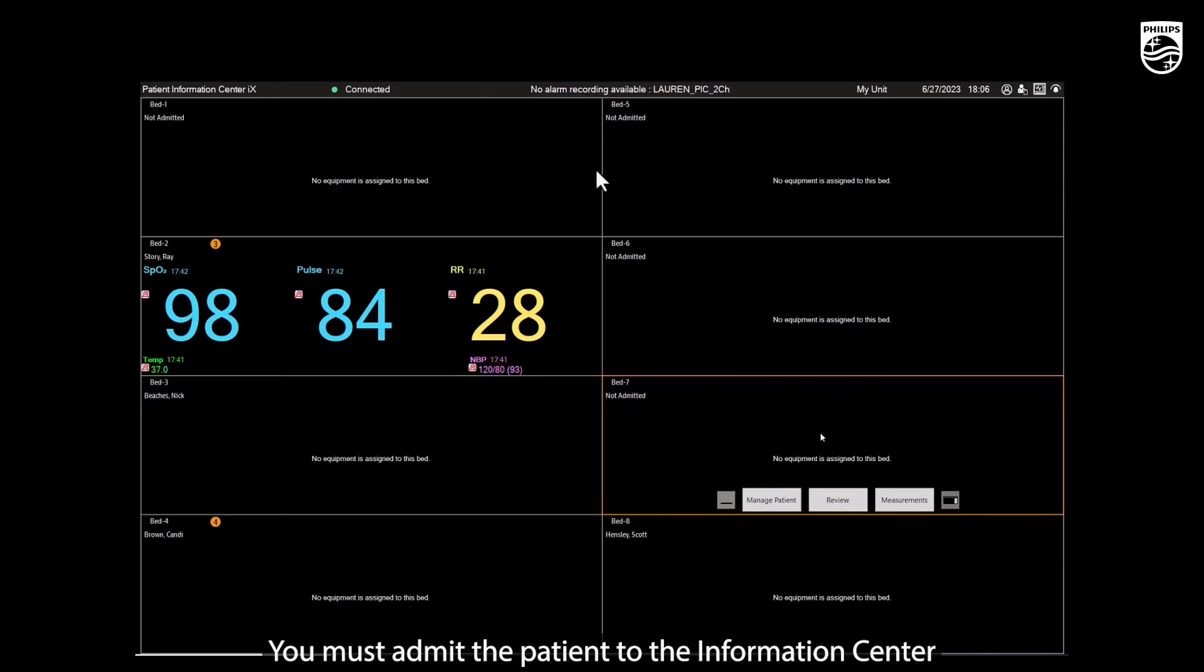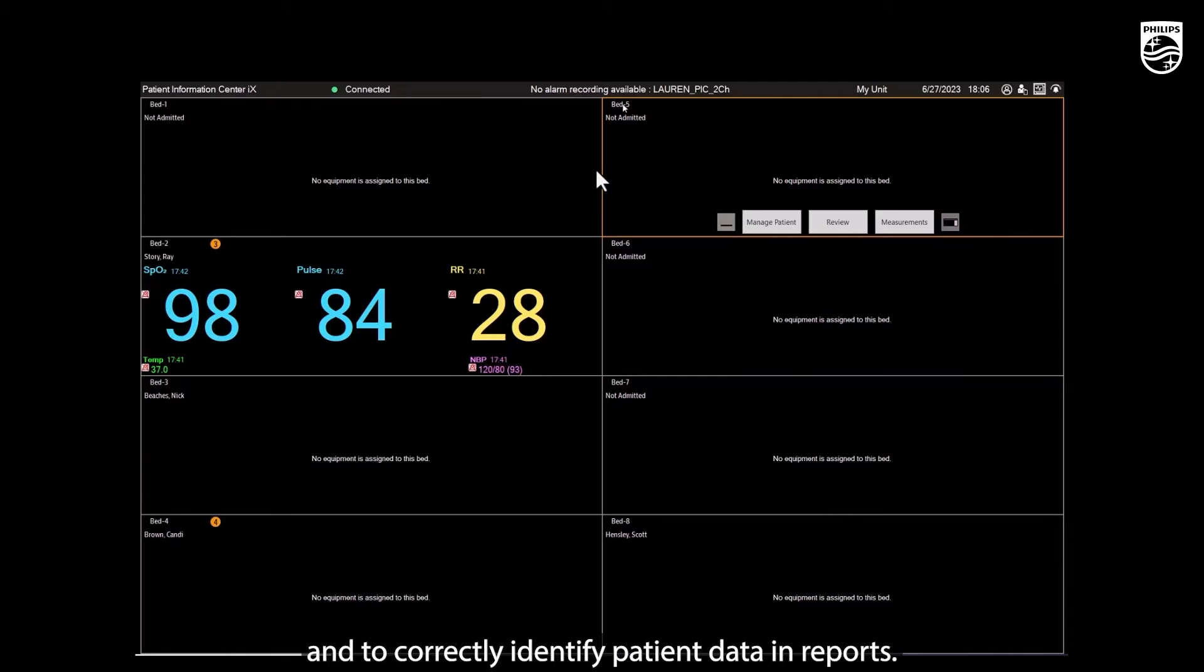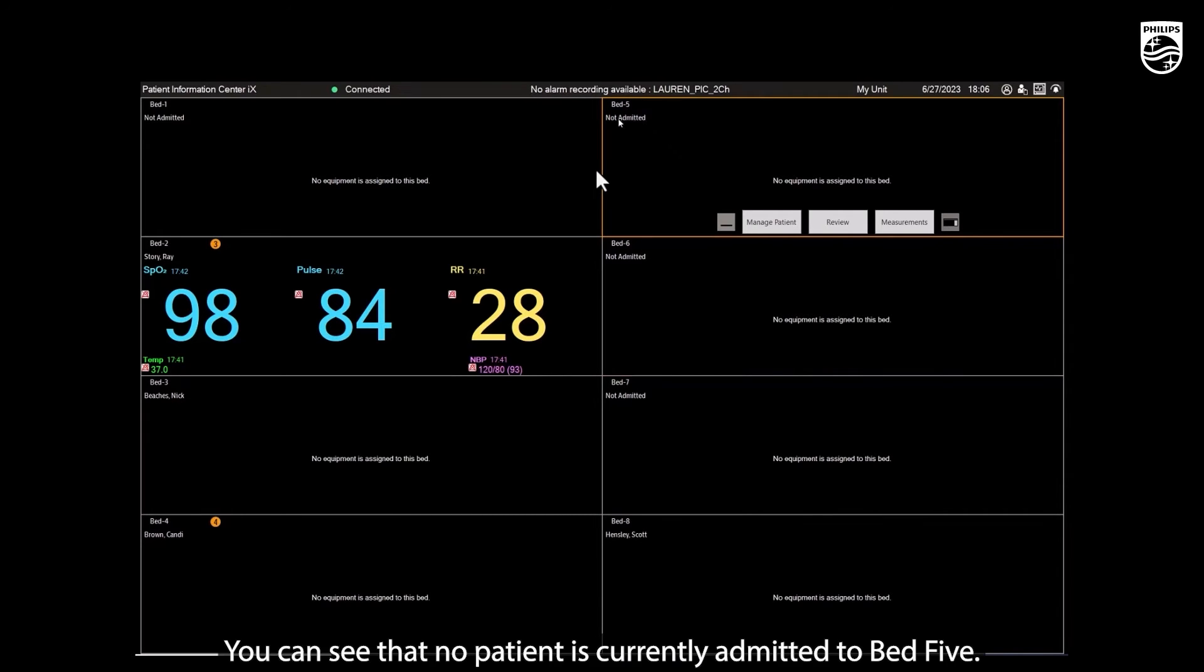You must admit the patient to the information center for their name to appear on the display and to correctly identify patient data in reports. You can see that no patient is currently admitted to bed 5.